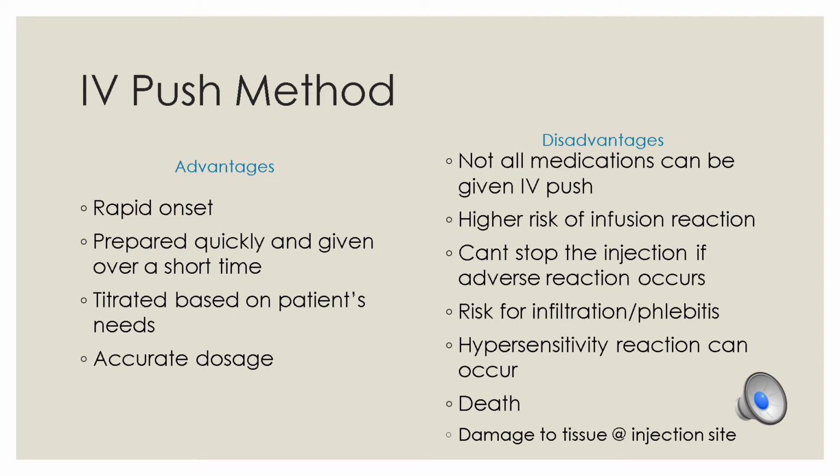Advantages of using IV push or IV bolus medication are that it's rapid onset, it's prepared quickly and given over a short time, it can be titrated based on the patient's need, and you can give an accurate dose. Remember, before giving any IV medication, you need to assess the insertion site to make sure there's no edema or redness. If the IV fluids do not flow at the ordered rate, do not give the medication, because accidental injection of some medication into tissue surrounding a vein can cause pain, sloughing of tissue, or abscesses.